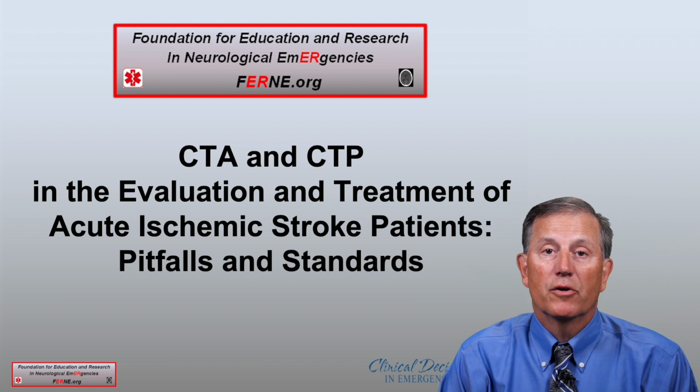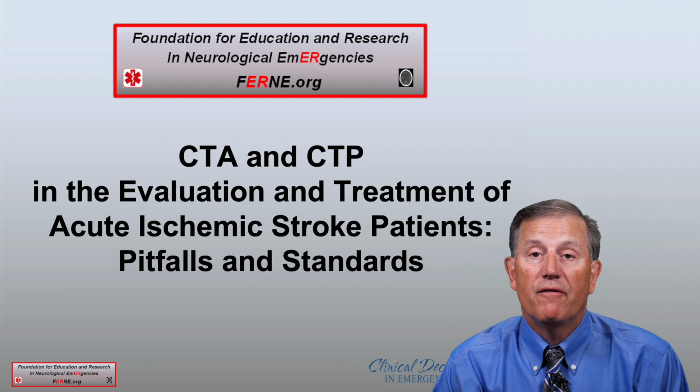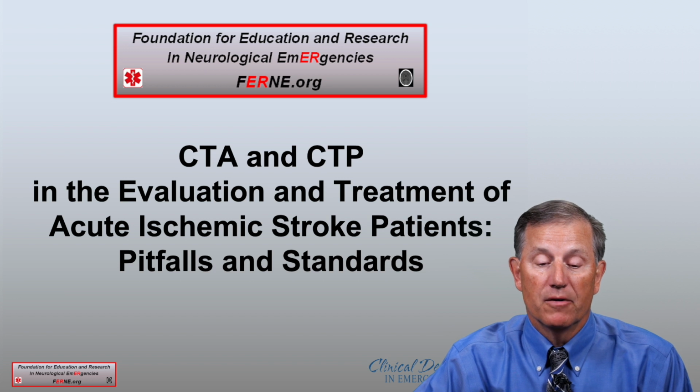Hello, today we are going to talk about the use of CT angiography and perfusion in the evaluation and treatment of acute ischemic stroke patients, addressing both standards and potential pitfalls.